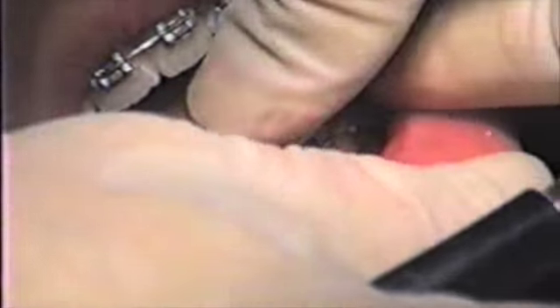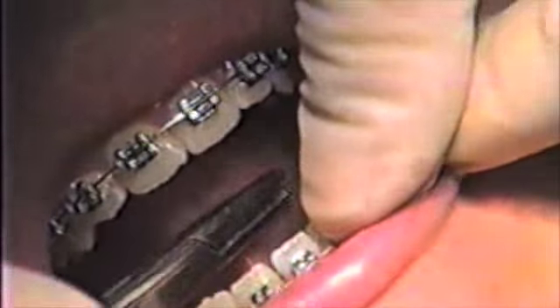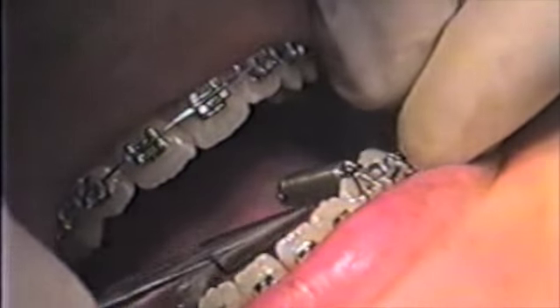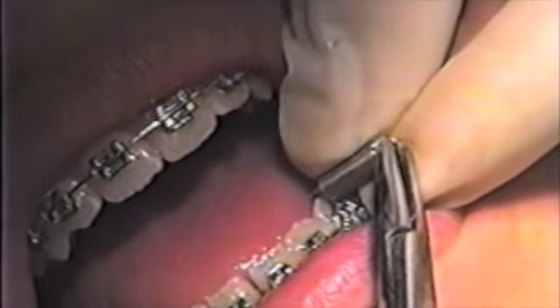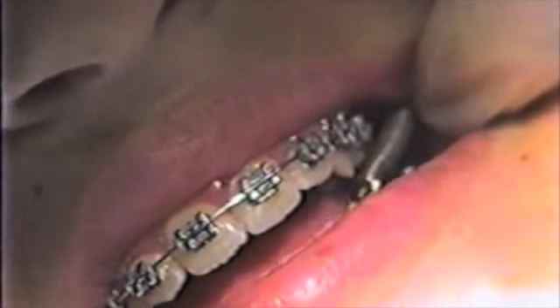Keep in mind that the force associated with a safe spring is very heavy. There is a new generation of nickel titanium safe springs that will probably take the place of these stainless steel springs.